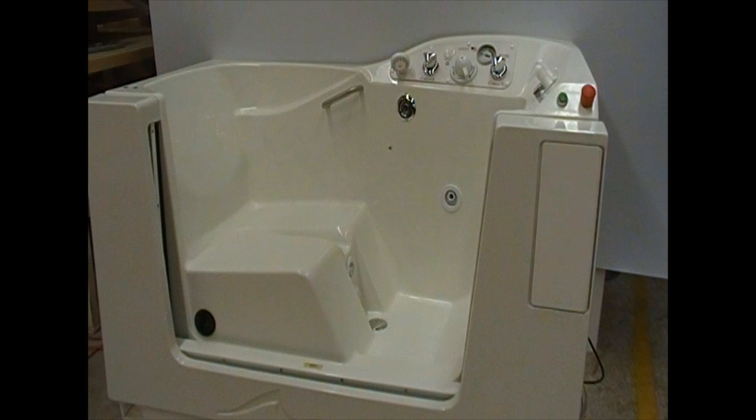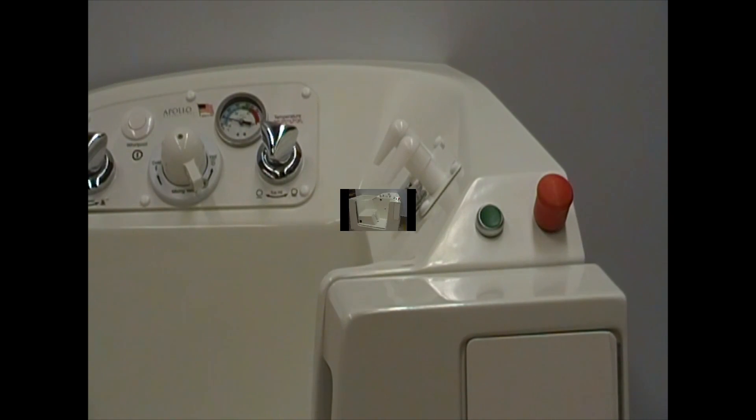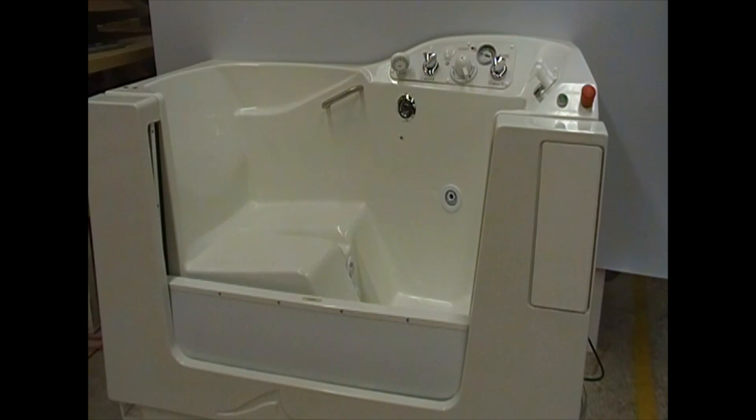To return the door to its raised position, simply push down on the green door operating button. Notice how it stays depressed. The door will now raise up and the actuator will begin to fill with air to seal the door.